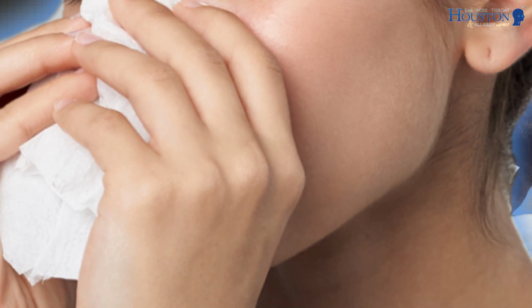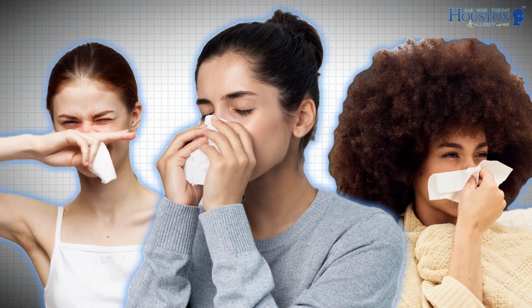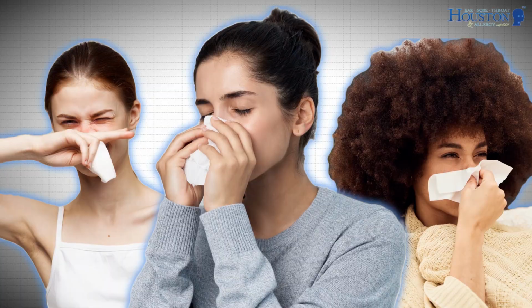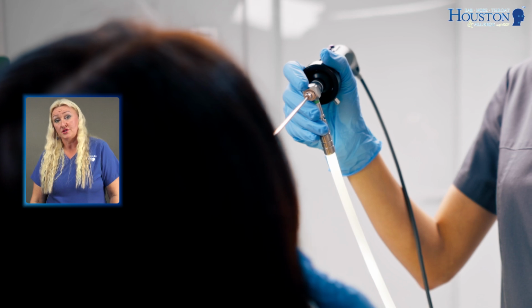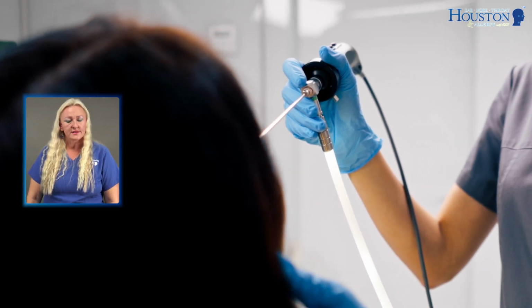If you are struggling with chronic nasal issues, trouble breathing through your nose, chronic mucus, post-nasal drip, or chronic sinus infection, a very important part of an evaluation is something called nasal endoscopy. Nasal endoscopy is a very quick procedure that only takes 2-3 minutes in my office, but it's going to help us identify the root cause of your problem.